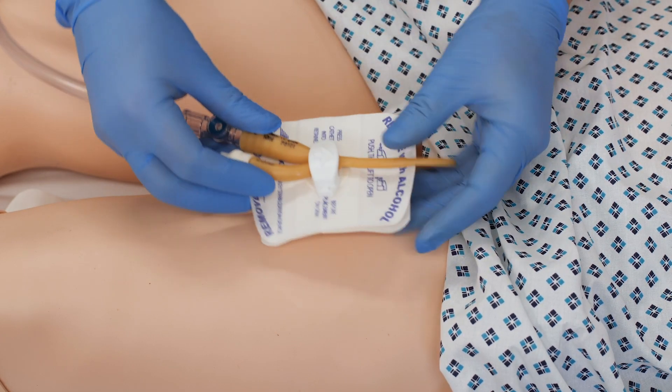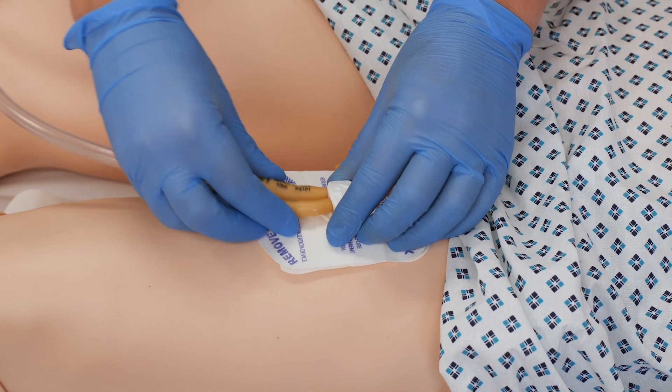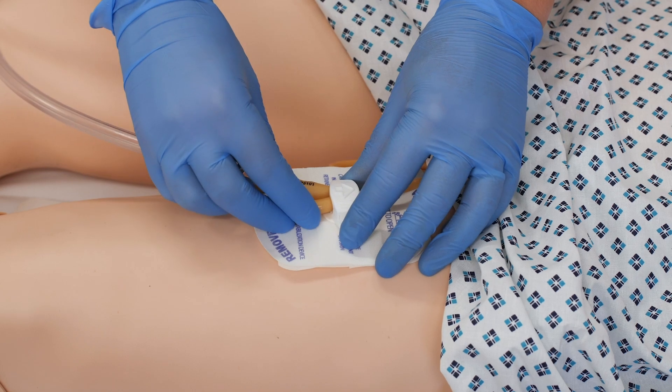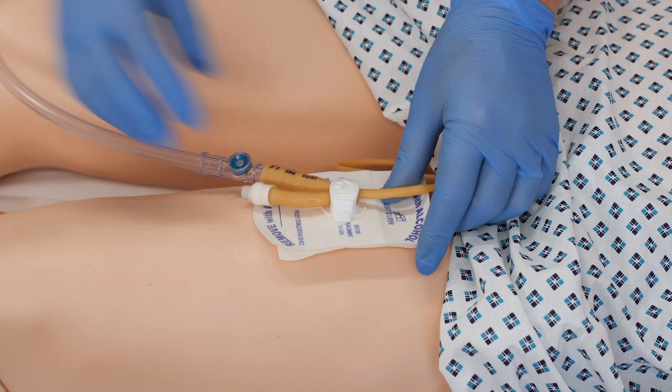It then locks into place so there's no movement, and the catheter sits snugly and securely in the device.